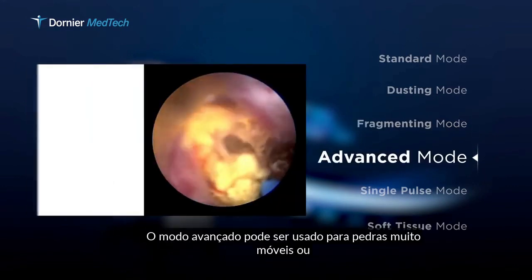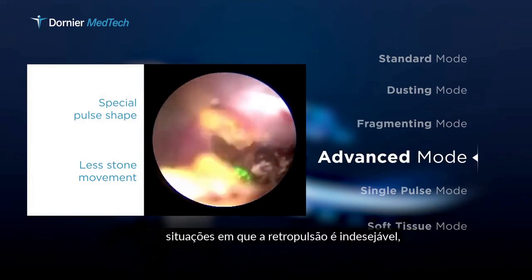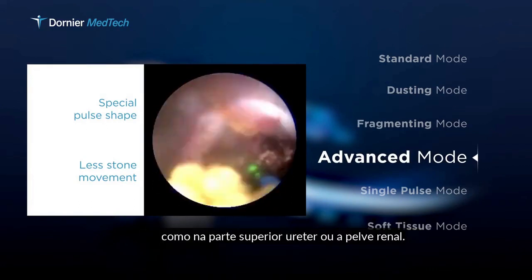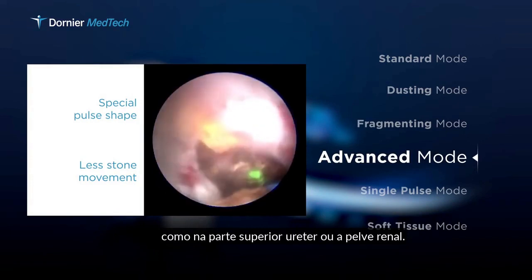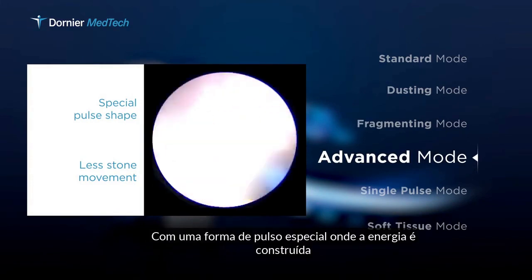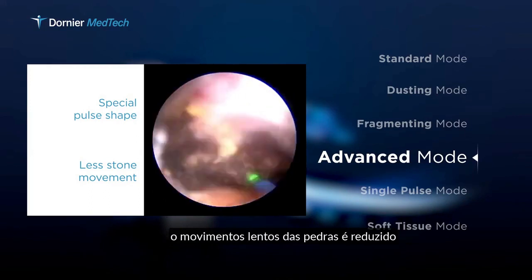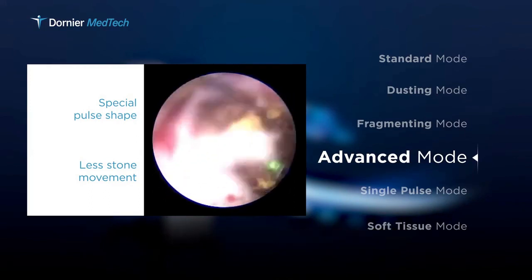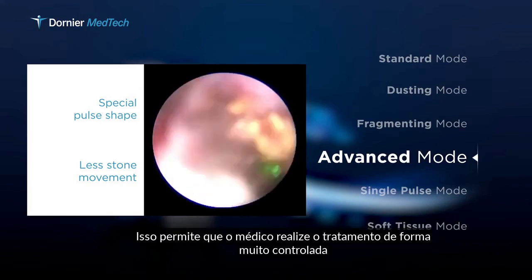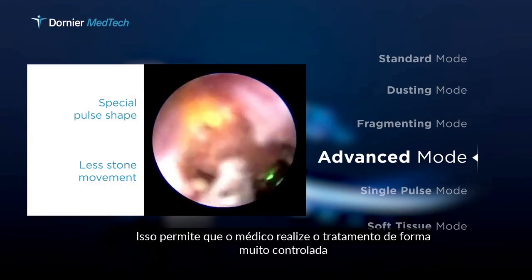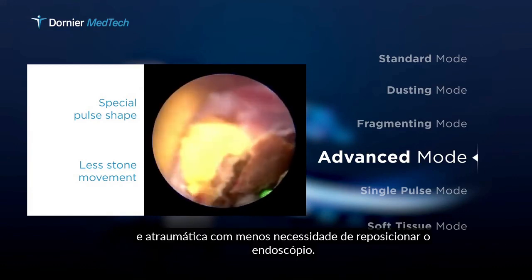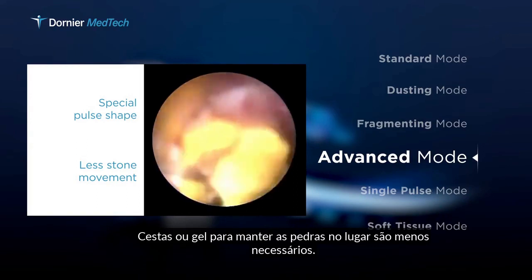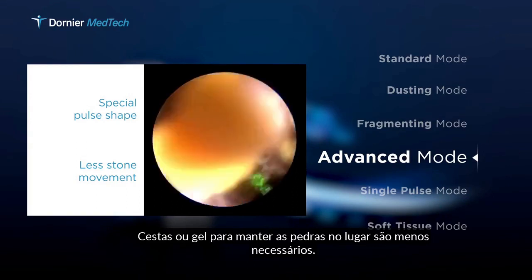The advanced mode can be used for very mobile stones or situations where retropulsion is undesirable, such as in the upper ureter or the renal pelvis. With its special pulse shape, where the energy is built up slowly, movement of stones is reduced. This allows the physician to perform the treatment in a very controlled and atraumatic manner, with less need to reposition the endoscope. Baskets or gel for keeping stones in place are required less often.